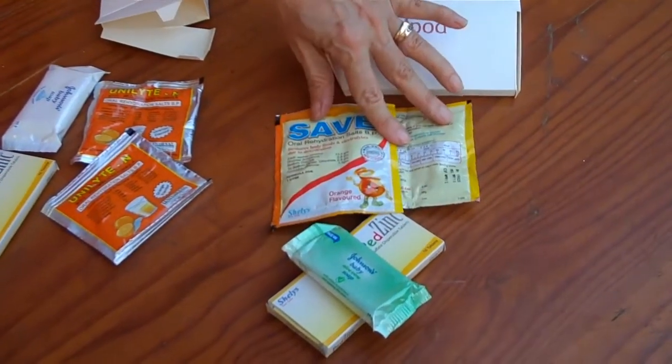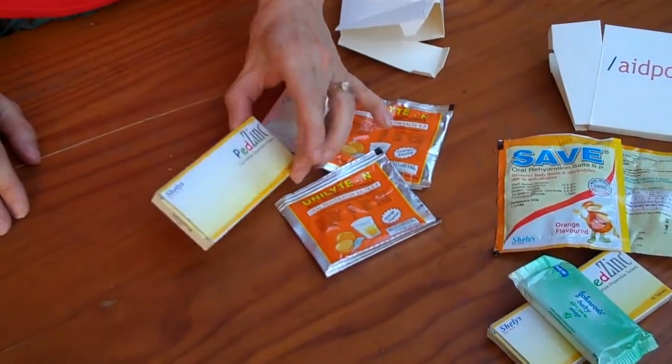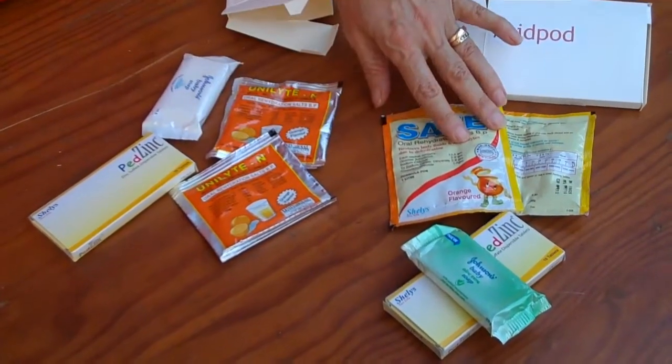Both of these sets of components are available locally. We've got the PedZinc, which is on the government list, and two kinds of oral rehydration salts.